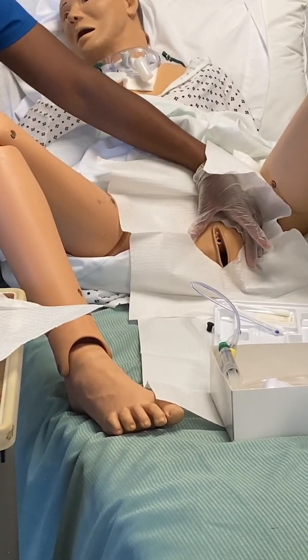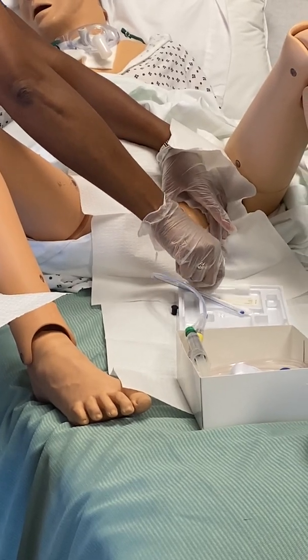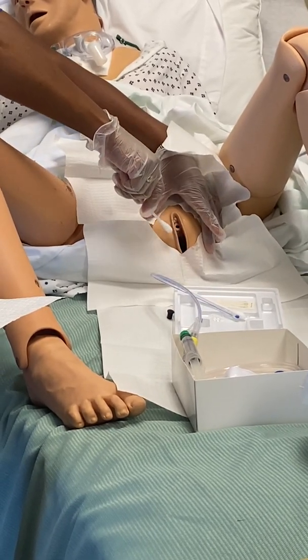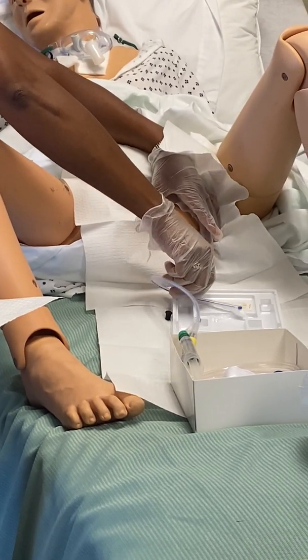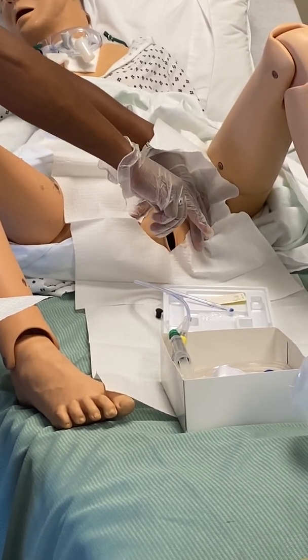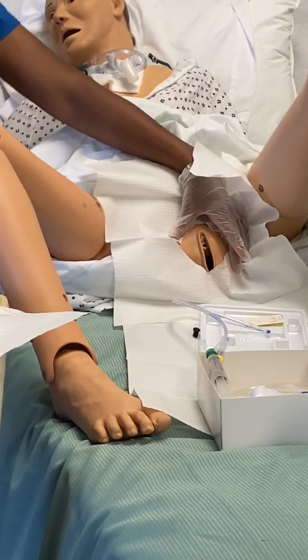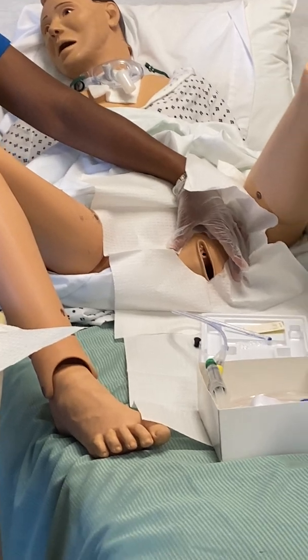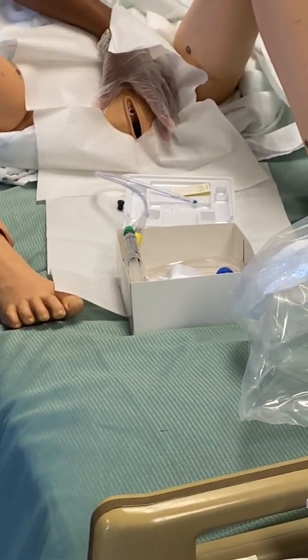Come around back, discard. I'm going to clean the other side. Okay? Down, back, discard. And then I'm going to clean the middle. Okay? Down, back, discard.